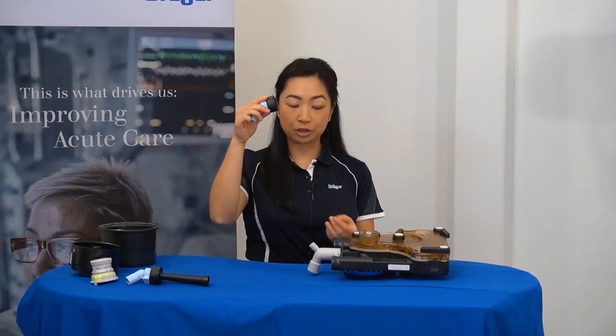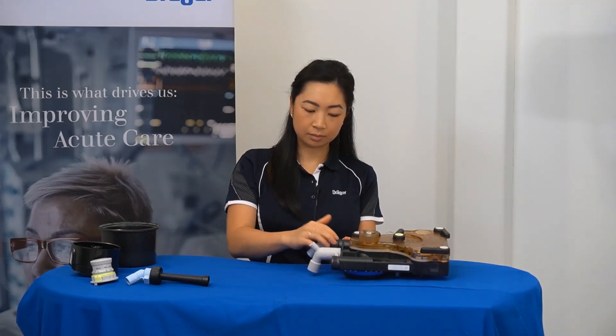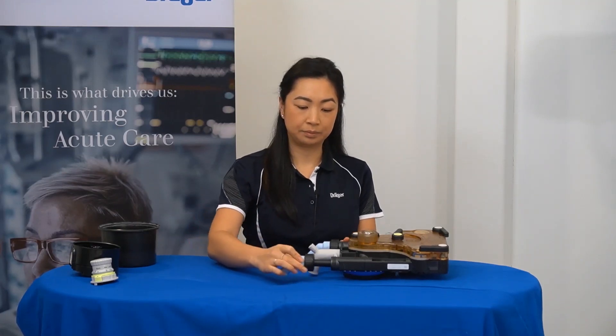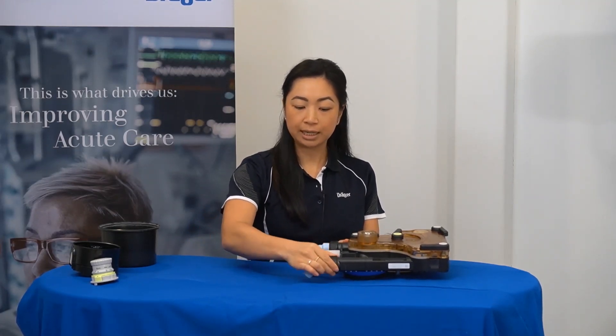Then, the inspiratory port at the top end and the expiratory port in the bottom one. Remembering there is a notch at the base of the port that aligns with the gap in the side of the breathing system. Ensuring it is finger tight.